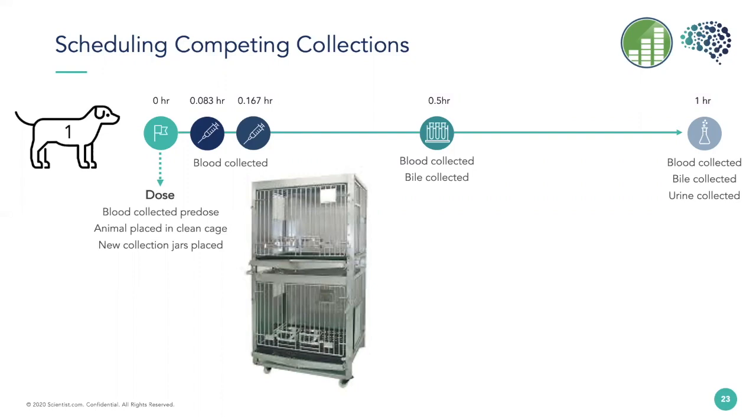And I'm guessing right now you're all thinking about how fun this looks, but I'd also like you to consider how many people are required to be in the room to complete these tasks for one dog, and that those people all have to be scheduled. So there's a doser, there's someone restraining a dog for the dose, there's someone collecting timed samples, and someone restraining the dogs for sample collection. And if you're lucky, you have someone recording the times for you. Oh, and by the way, don't forget to get the samples in the centrifuge within 30 minutes.